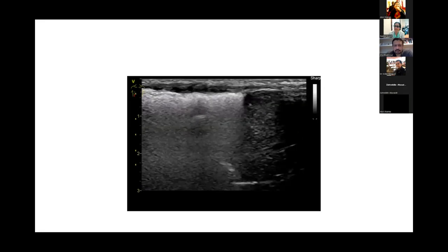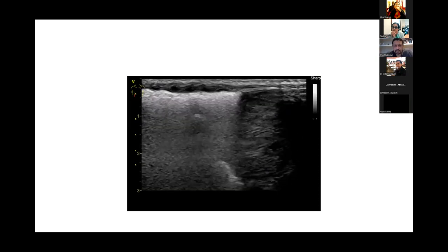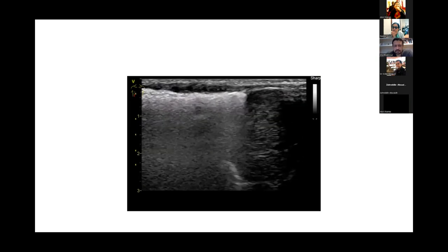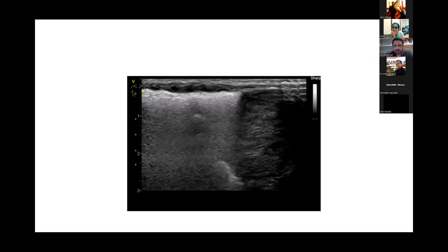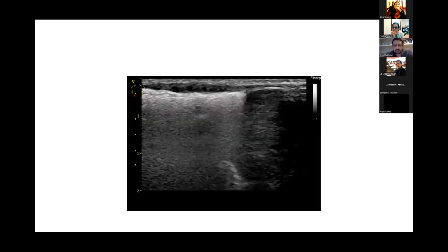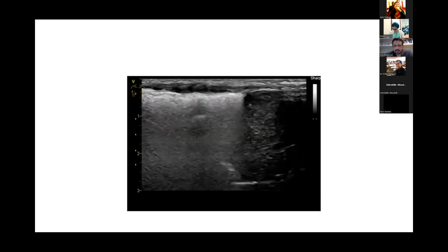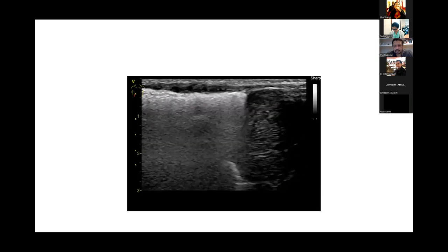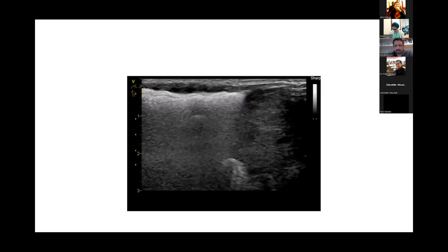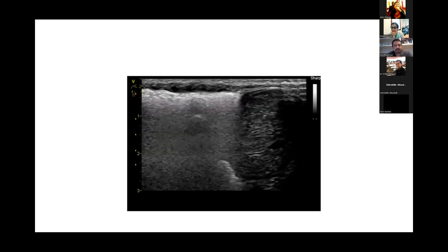From the images that we've looked at, on babies with chronic lung disease, it's more of a less aerated lung, probably predominantly B profile with some fluid mainly causing this. This is my feeling about the chronic lung disease. Was that the question, chronic lung disease or PIE? My question was mainly about PIE.